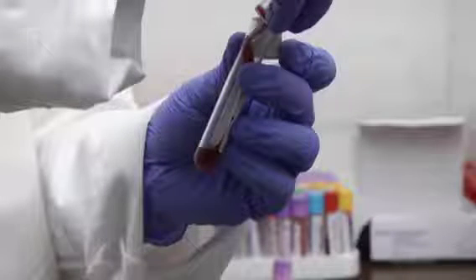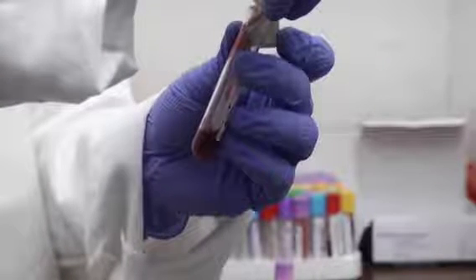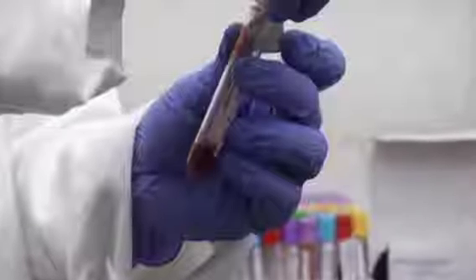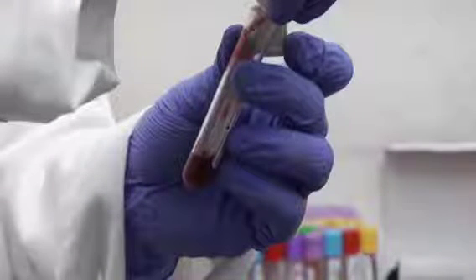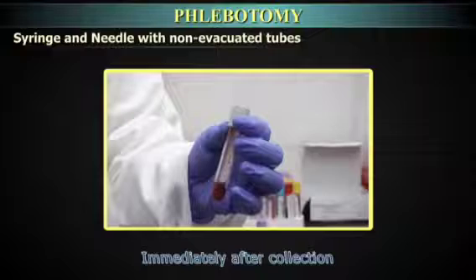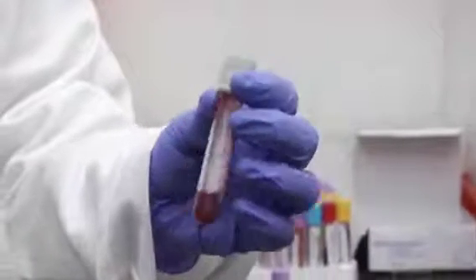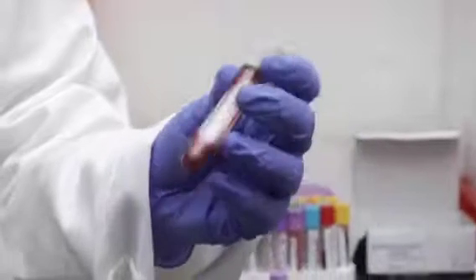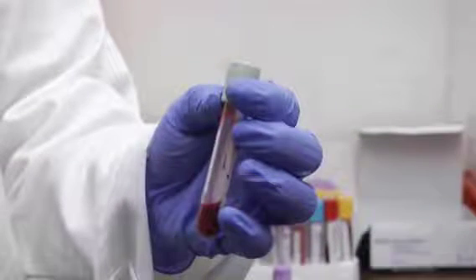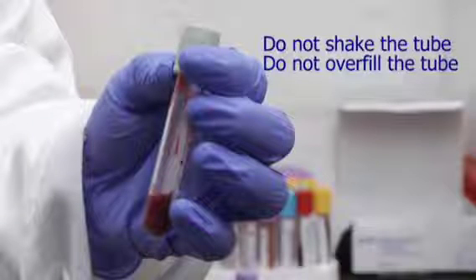Phlebotomists should never push the plunger too hard, in order to avoid froth formation or hemolysis and the risk of aerosol formation. Immediately after collection, gently invert the tubes containing additives for the required number of times as specified by the manufacturer. Do not shake the tube. Do not overfill the tubes.